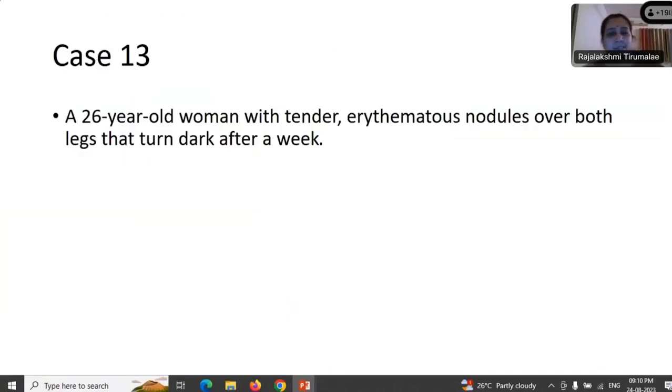So any comments from the chairpersons? So we can go ahead. I think just a brief comment: you already mentioned the early lesion of bullous pemphigoid, what it shows. Another pattern it can show is an intraepidermal spongiotic vesicle, and the same is true for pemphigus, where there may be intraepidermal spongiotic, neutrophilic spongiosis. So these patterns also should be kept in mind when the clinical diagnosis is query pemphigus or query bullous pemphigoid. Thank you.